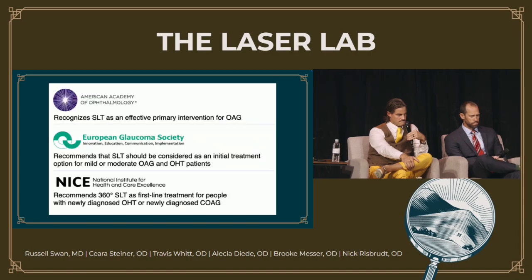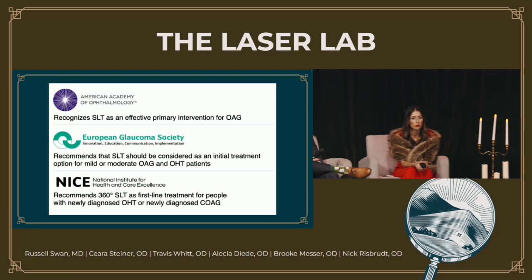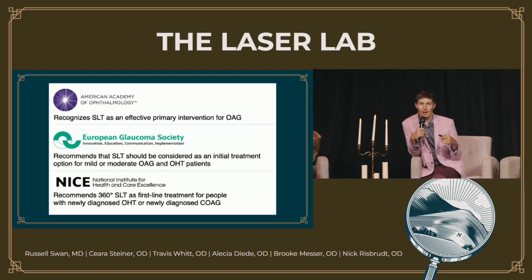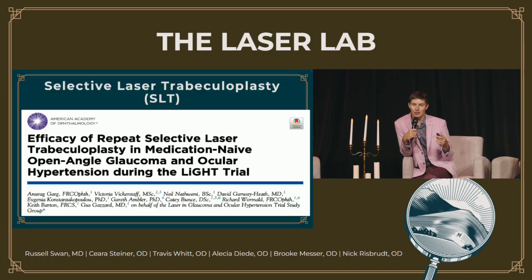And I think, again, you actually see this in a lot of the academies now recommending it. Historically, that was never recommended as first-line treatment. Now, pretty definitively, a lot of the academies, glaucoma societies, and otherwise are recommending SLT as first-line therapy, which I think is supportive of the evidence that's out there. And we also know that it can be repeated.